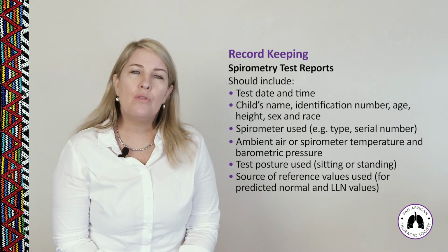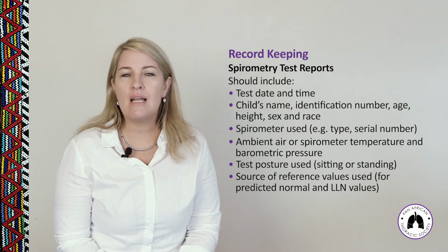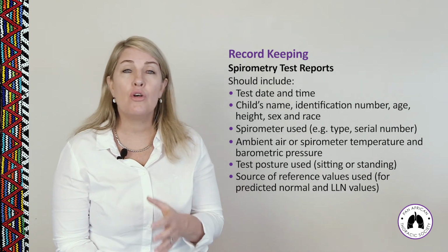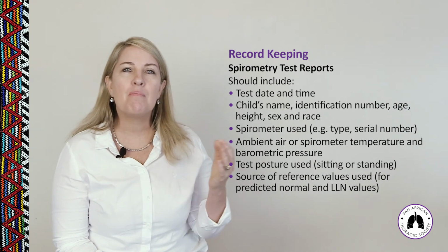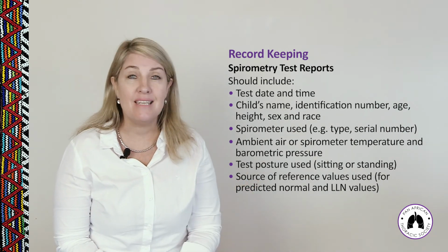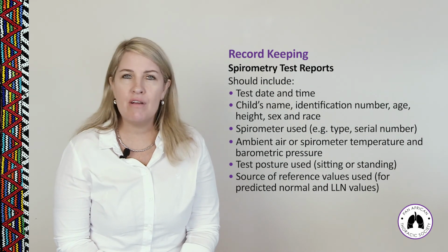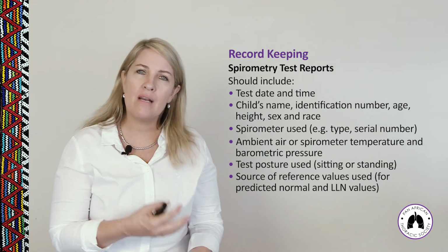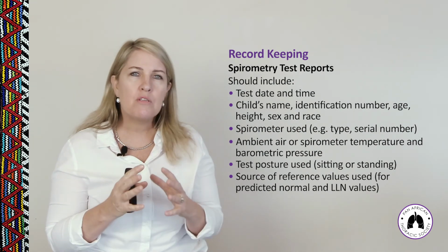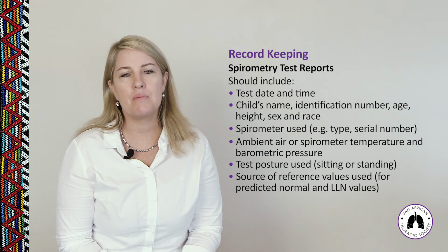We need to know that the spirometry test report needs to tell us the results of the 3 best curves. So it's not good enough to just see the best data. We want to see data from the best 3 tests done at least, so that we can look at every test for acceptability and repeatability and look at the measurements one to the other. We want 3 almost perfectly identical spirometry measurements.